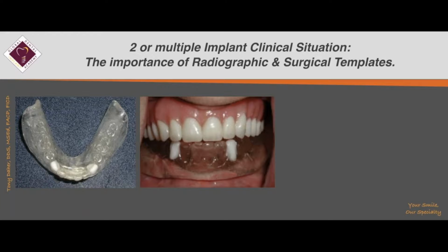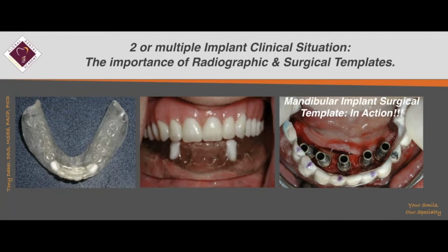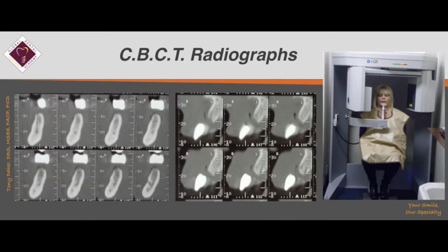And then that pre-surgical denture, we're going to duplicate it and turn it into a radiographic template. And that radiographic template also is going to be turned into a surgical template. And according to that, you make your diagnosis and you get a predictable result. For us, CBCT radiographs are a good diagnostic tool if I can see the silhouette of the final destination. Certainly, if you don't see that, you can see the silhouette of the bone.